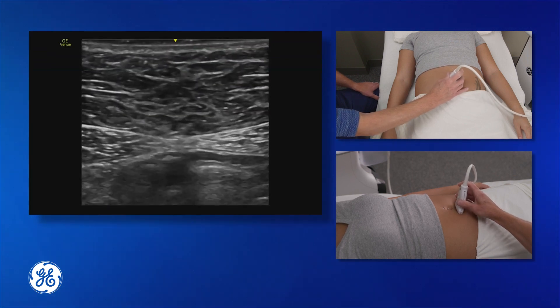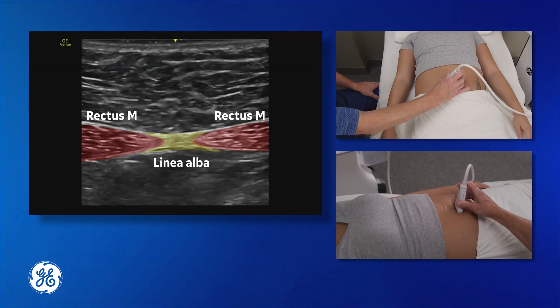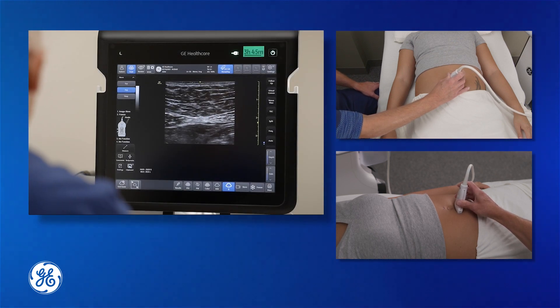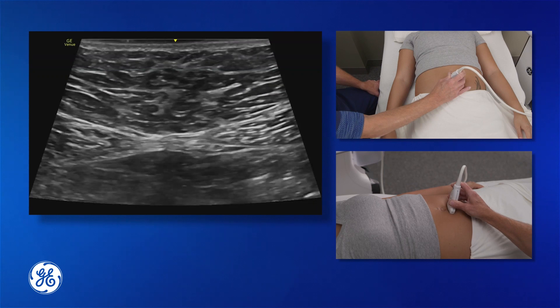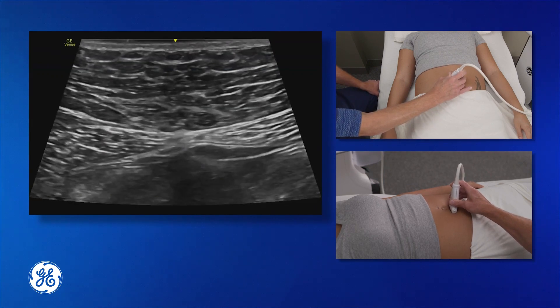We can see the start of our rectus muscles and our linea alba running through the centre of the screen. One of the great things with the GE Venue system is we can turn on virtual convex, which will give us a wider frame — a curvy linear array from our high frequency array — giving us better visualisation of those muscles.